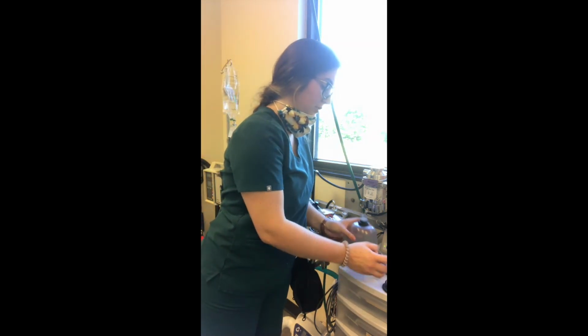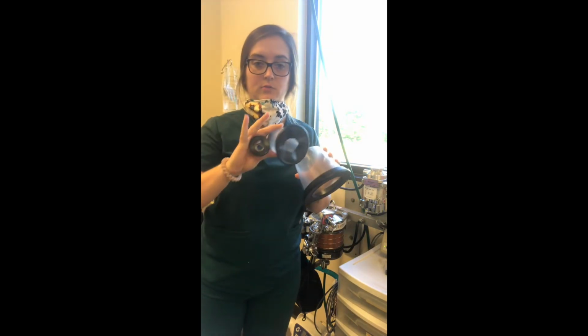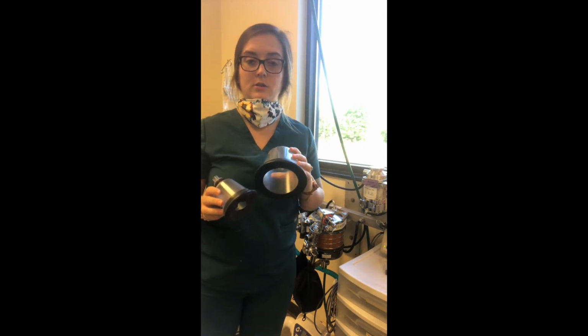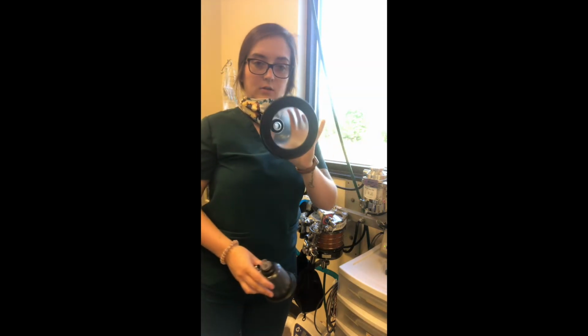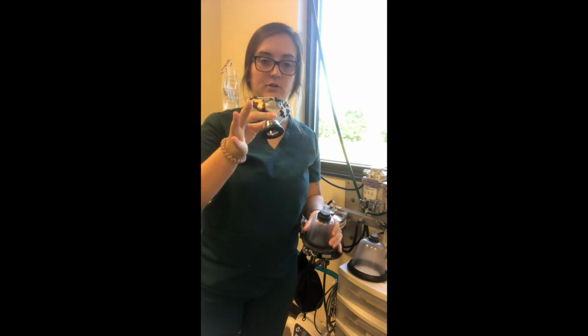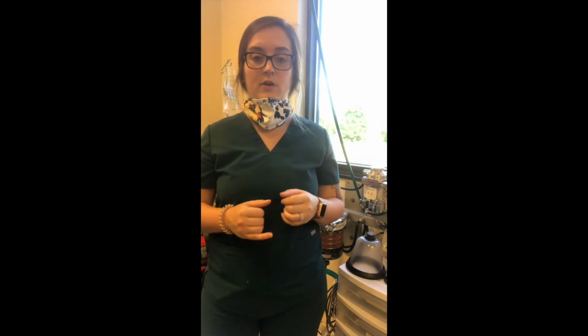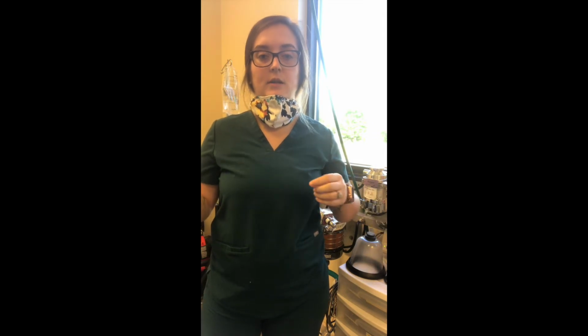We have a couple options for inductions for masks. We usually don't mask down animals. We reserve these for flow-by oxygen for animals that come in just needing some extra support. Large ones, medium ones, and then very small ones. Some practices use induction chambers for feral cats or an animal that they can't handle or something like that. We don't have those here. We are a fear-free practice and try to not have to do that.